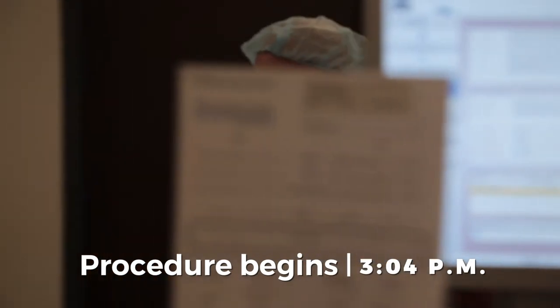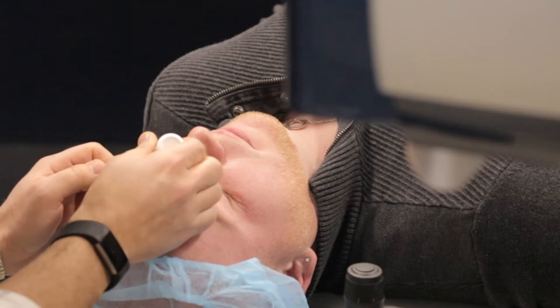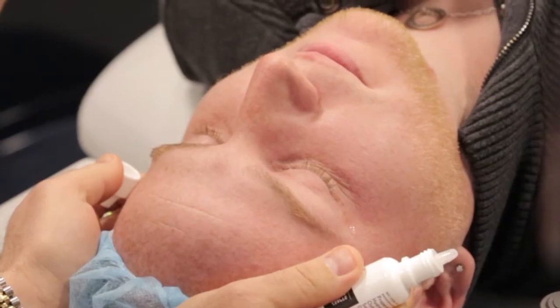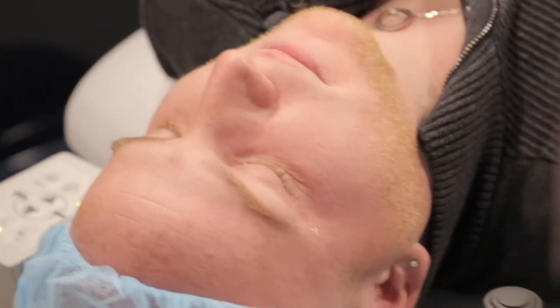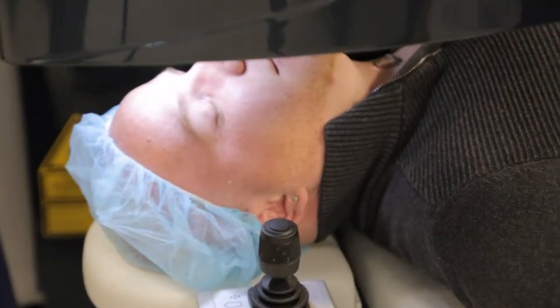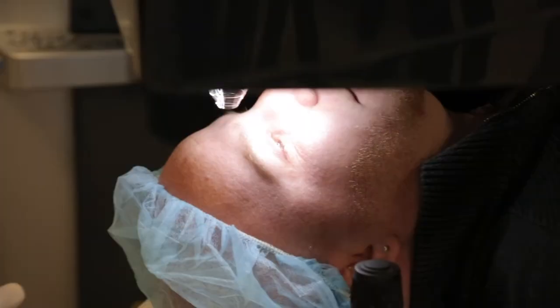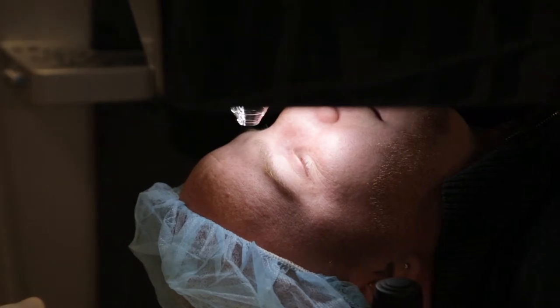That's your bed — Chris is going to position you. We like you, so we're going to give you extra numbing medicine. Close your eyes. All kidding aside, take some nice deep breaths and picture yourself in your happy place. Now we're positioning him under the first laser — the femtosecond laser. We're about to create what we call the flap, which is what we do prior to the treatment that gets rid of his prescription. This fancy machine is going to come close — for about 20 seconds it gets a little awkward, you feel a little pressure, really no pain at all.